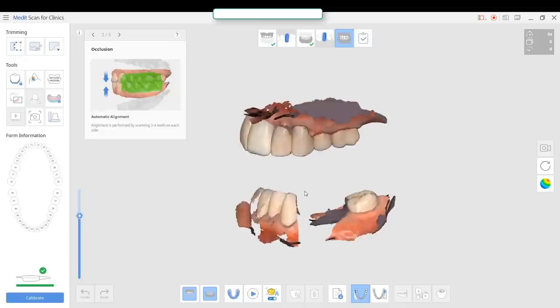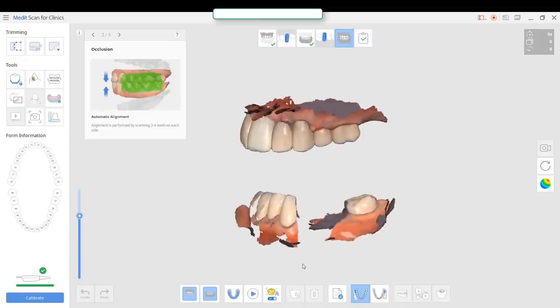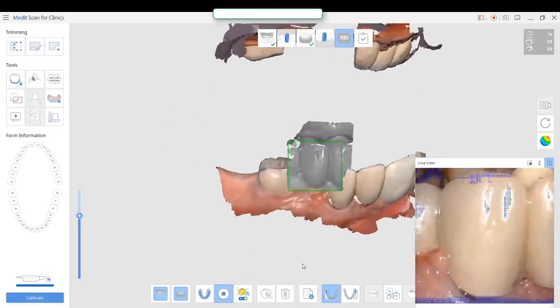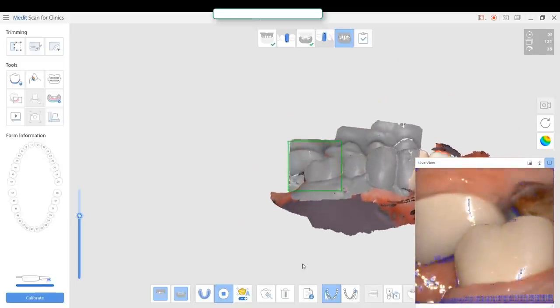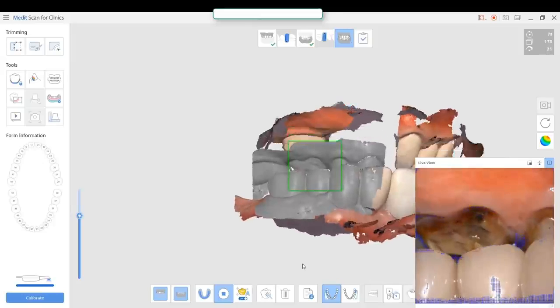Okay, so those two teeth are going to be prepped, modified, refined, and now I'm going to have the patient bite down, and notice how with the buccal bite, or the alignment of the upper arch to the lower arch, I start very mesial in that equation. I'm starting by the lateral, the canine, and the upper jaw related to the bite very readily and easily.